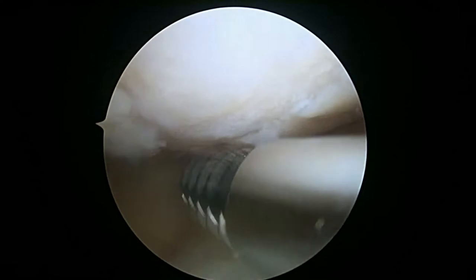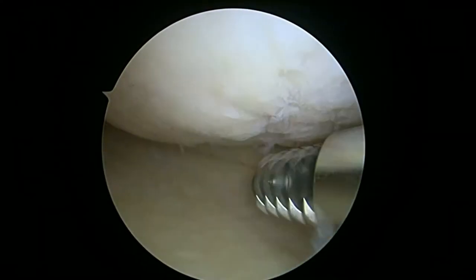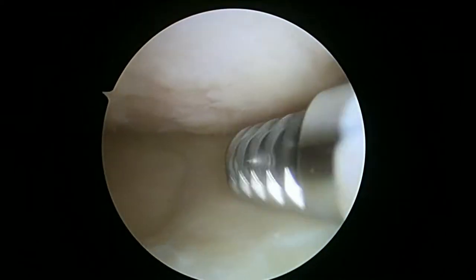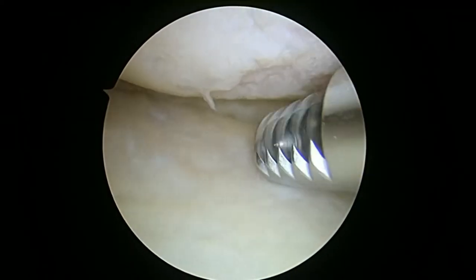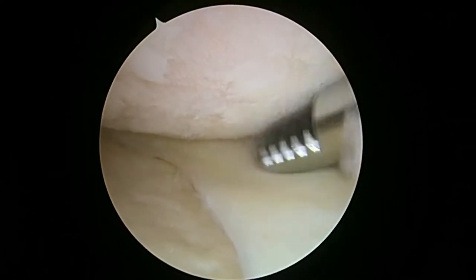We're just getting started on the right knee. We're looking in the medial compartment here, and as we look at the femoral condyle up above, we can see you've got some arthritis. It's what we expected, and what we're doing here is just going around the edges, making sure there's nothing really loose. And we can look all the way towards the posterior aspect of the femoral condyle, and you can see where the cartilage is kind of rough and not smooth anymore.